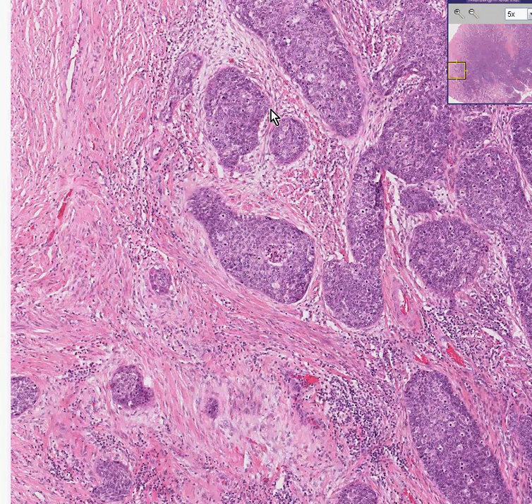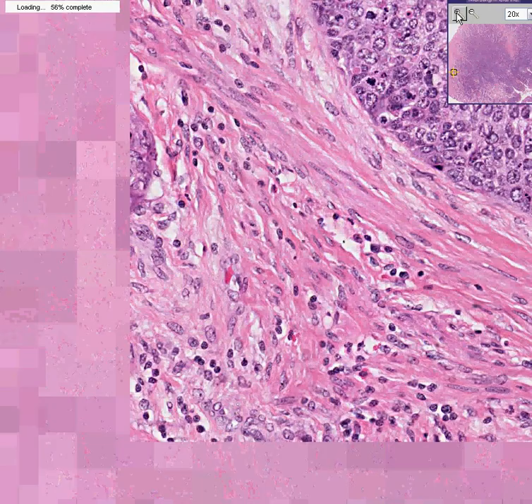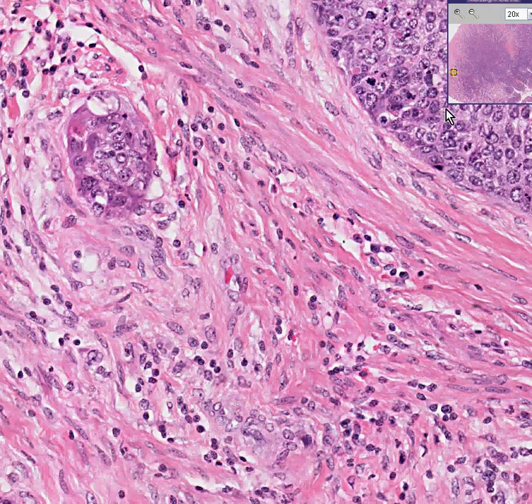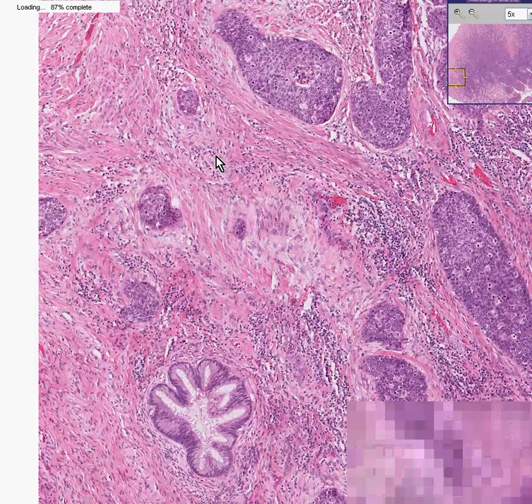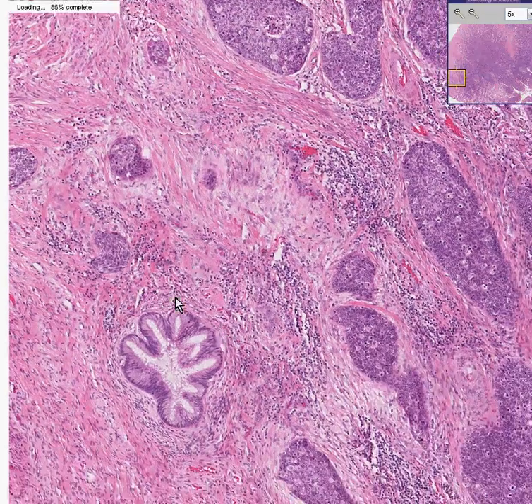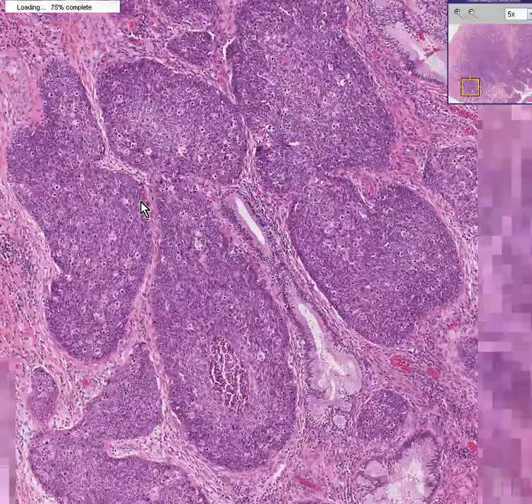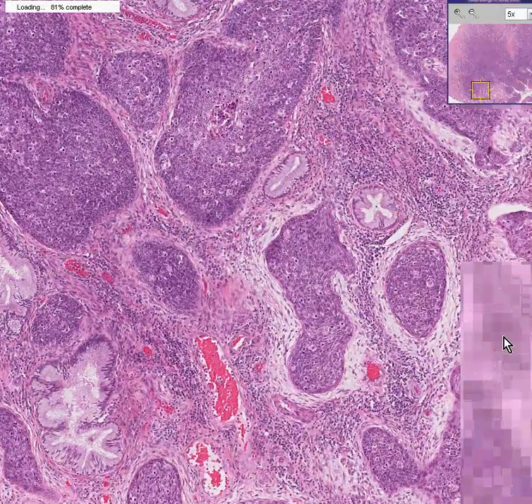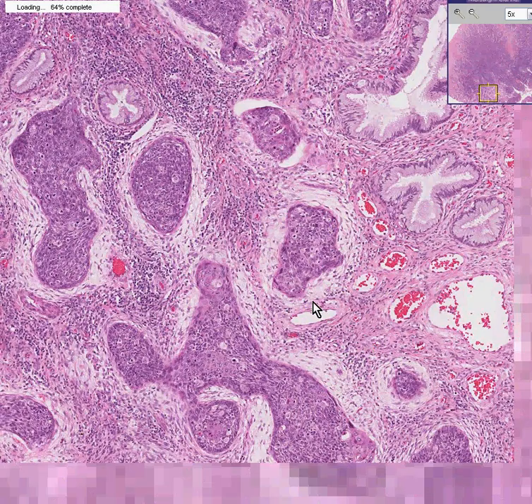Notice how it very irregularly and haphazardly infiltrates through this fibrous connective tissue — these are all fibroblasts and collagen. Notice how it is next to some normal-looking endocervical glands, and here's some more normal glands: normal glands, tumor, tumor, tumor, normal glands.